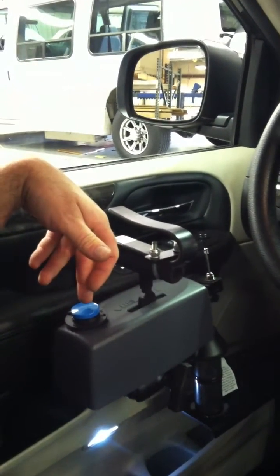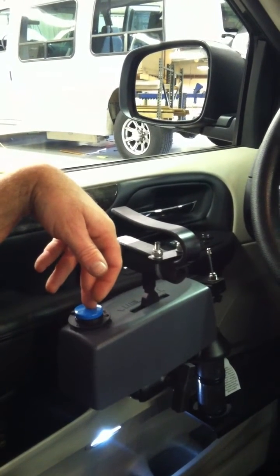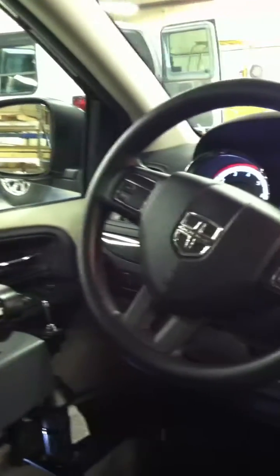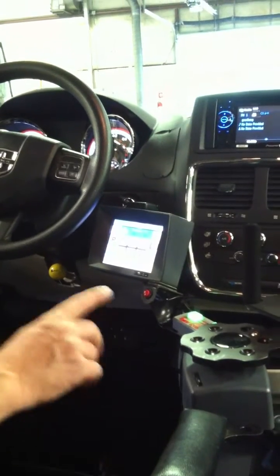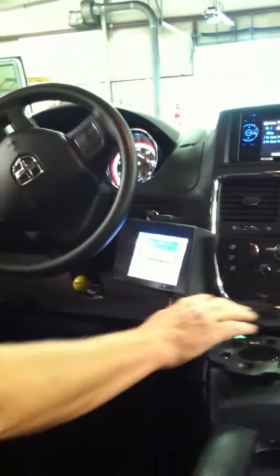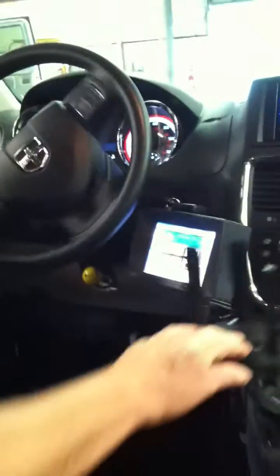You can also roll the windows down with this. And you're ready to go. This would be for a person who has a little more mobility than just the joystick driver. Thank you very much.